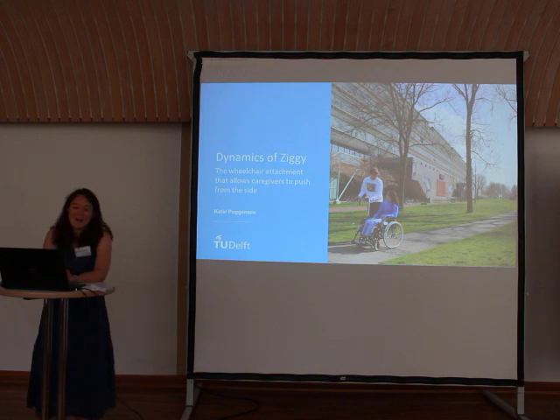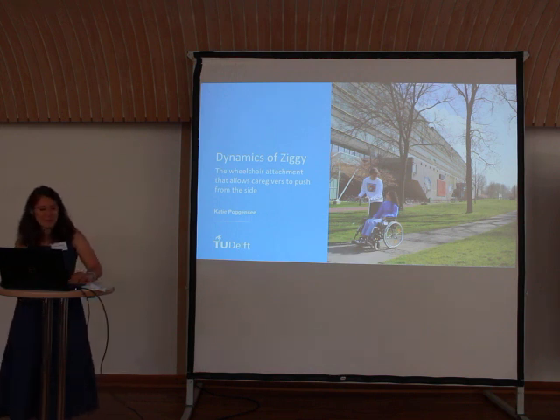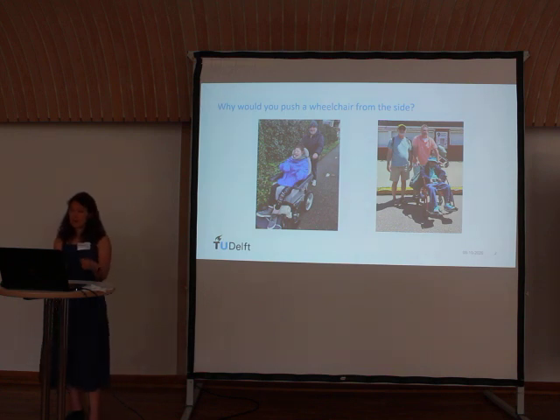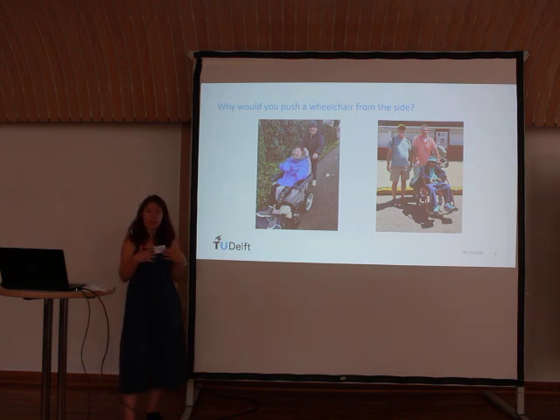Thank you. So yeah, I'm Katie, and I will be stretching the definition of dynamic walking today and talking about a wheelchair. So the main point of this wheelchair attachment that I'll be talking about is for populations of people that cannot be pushed from behind. So usually the caveat that people always say is, well, why don't you just have a motorized wheelchair? So you can think of at least two cases where you still want a caregiver involved in the transportation of the individual in the wheelchair.